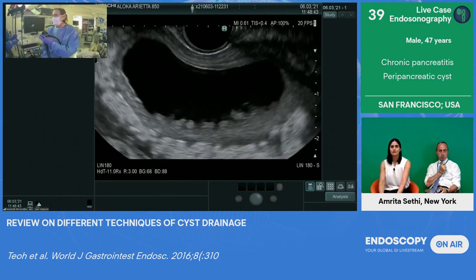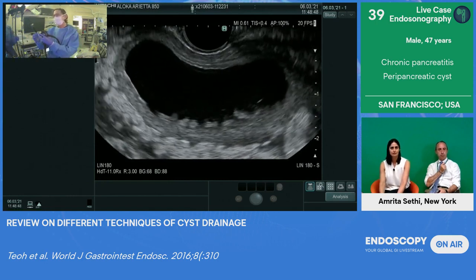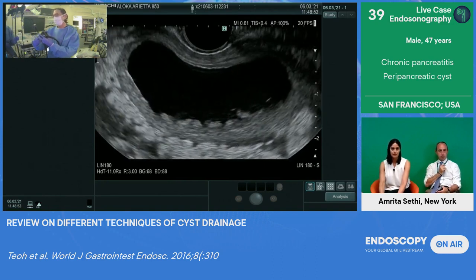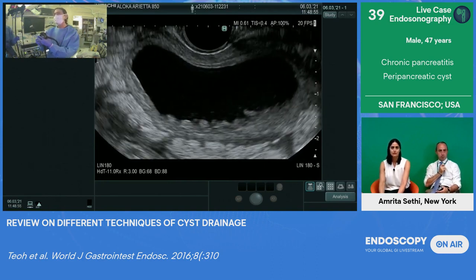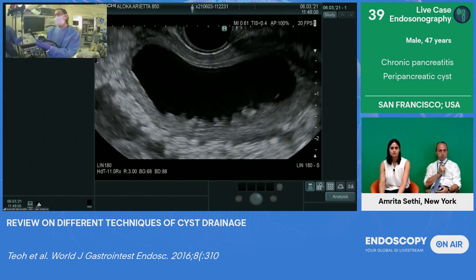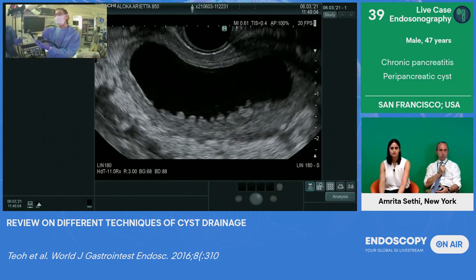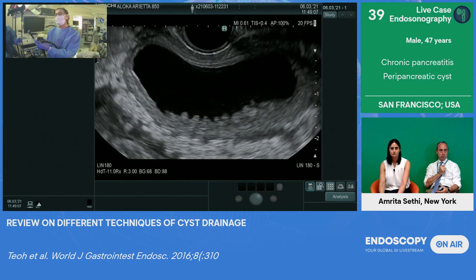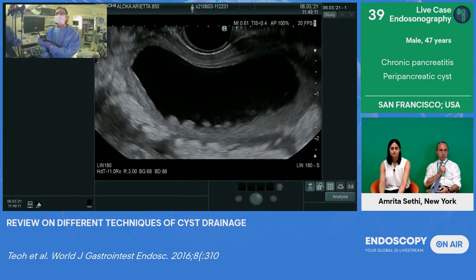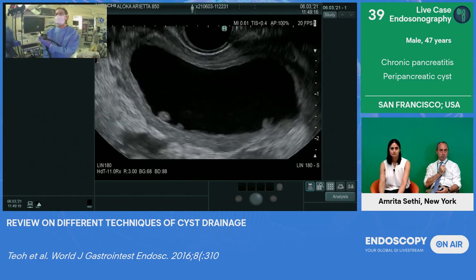The numbers you were referring to were the diameter. I believe now there's also 2 saddle lengths available, a 10 and a 15. How do you choose which one to use? That's correct. So, generally, I rarely use the 15 saddle length because if it's already that separate from the wall, I just have some other concerns that need to be addressed, but usually the 10 millimeter saddle length is sufficient.